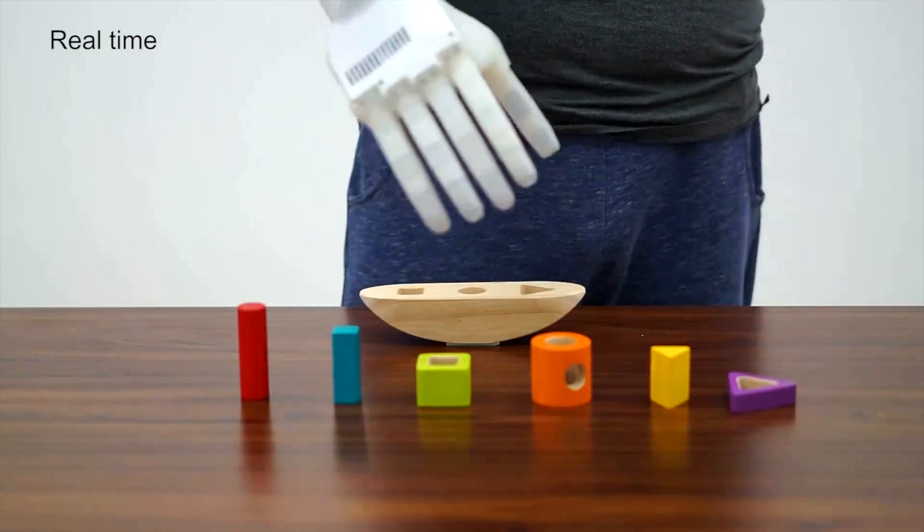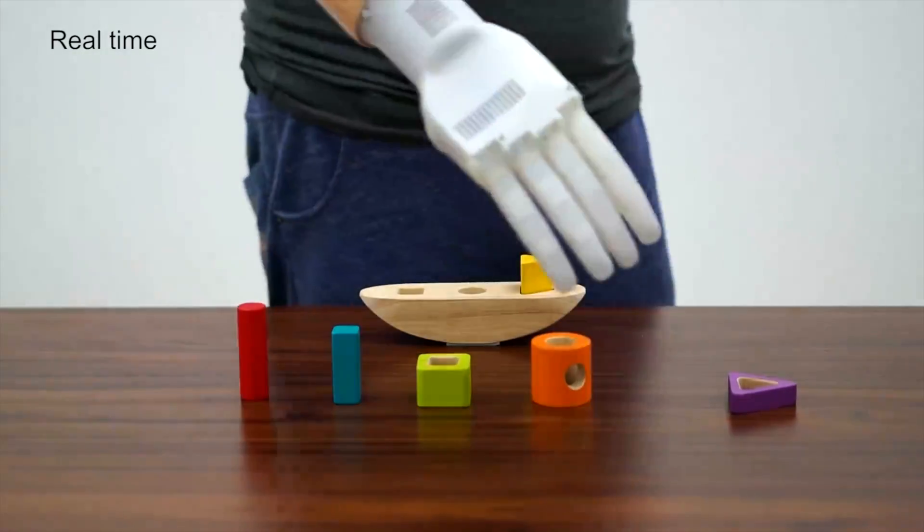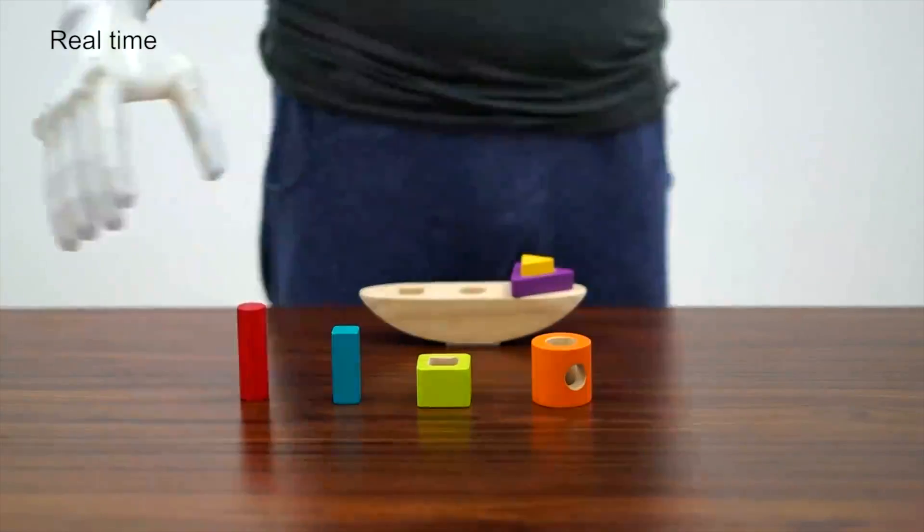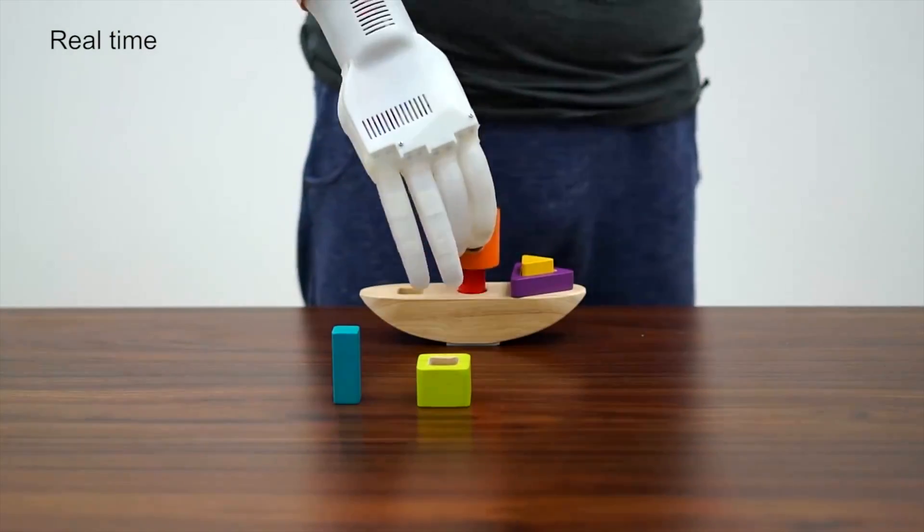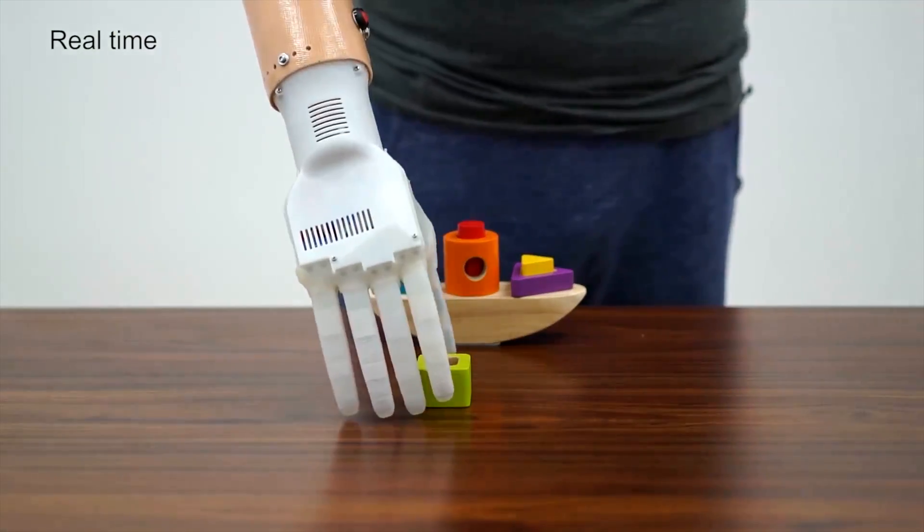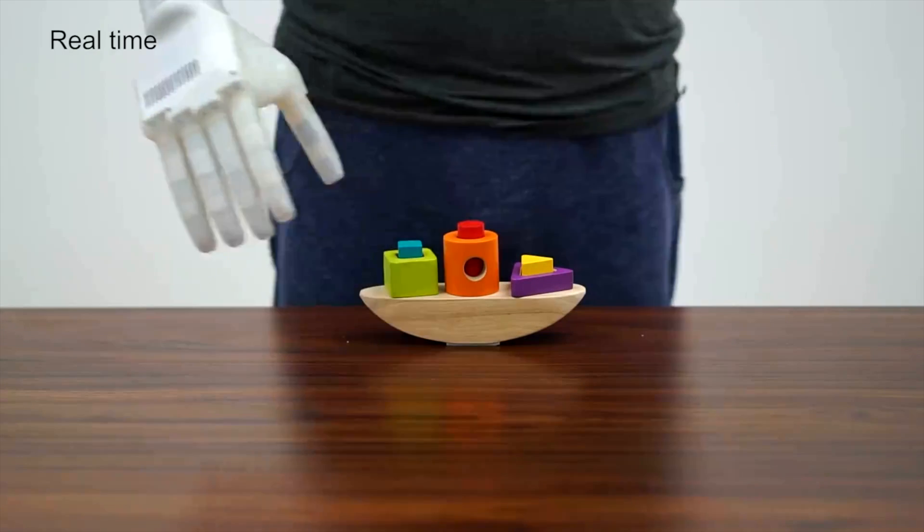Their new smart hand is comprised of five fingers made from a soft, stretchy material and weighs about half a pound, a fraction of the weight of traditional prosthetics. The fingers are then attached to a 3D-printed palm shaped like a human hand.